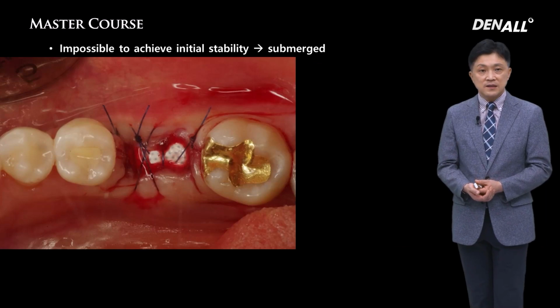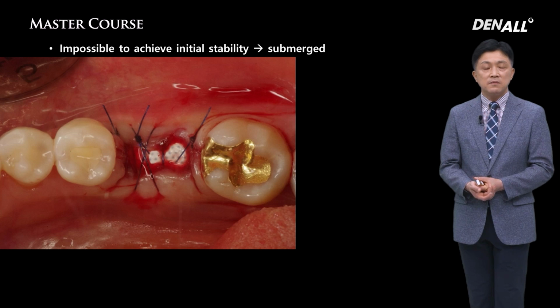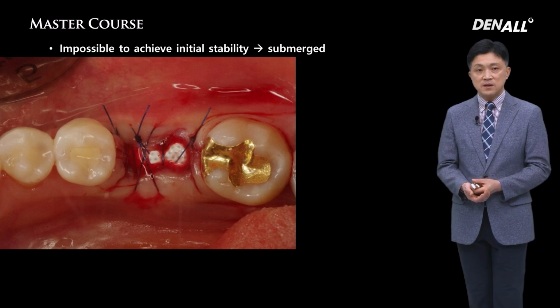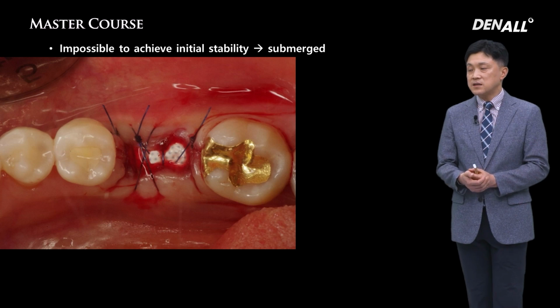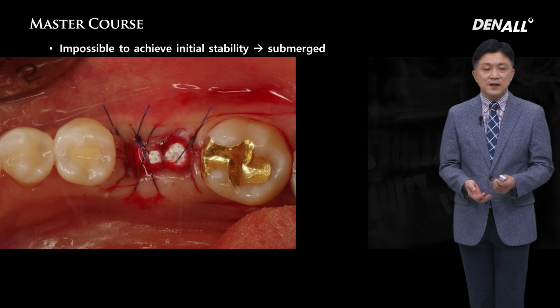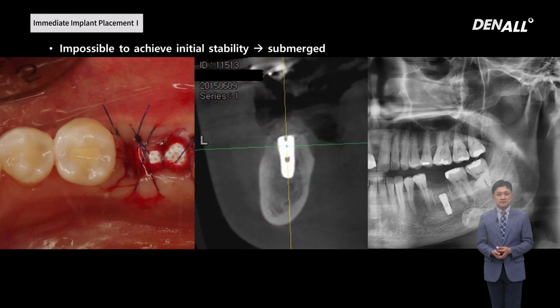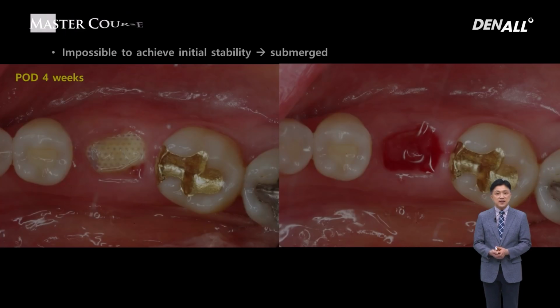This is a technique you can use at times. Bone graft is done. In this case, non-resorbable PTFE membrane was used. It was covered and suture was done. When you do suture, you do not need to strain yourself to get the full primary closure. This is post-op image. CT. You can get better result if you do overgraft slightly.